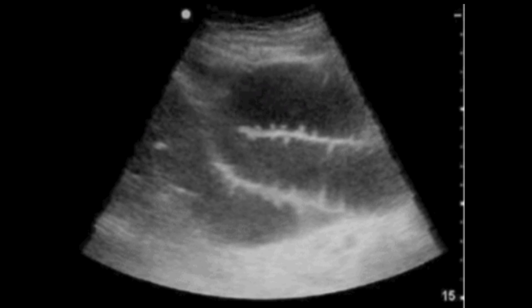The bowel is not going to do peristalsis. It's going to be static. So then you know how to diagnose ileus. It's not with a stethoscope. Okay, I know you guys still have stethoscopes.